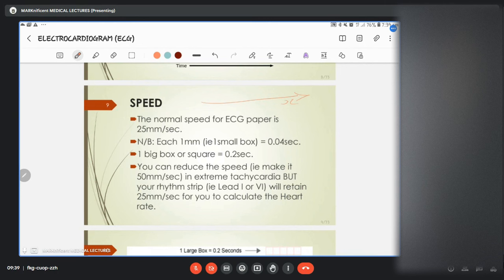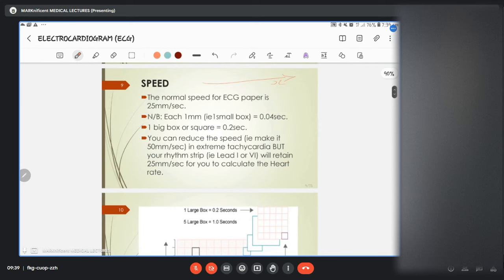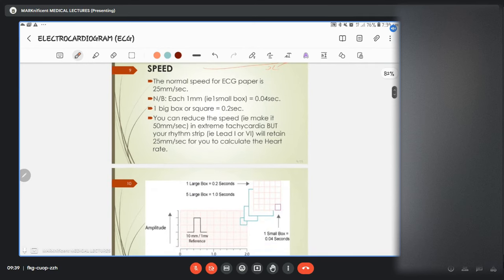So what this means is that on each small box, you have 0.5. No, sorry, on each small box, you have, okay, yes, you have 0.25, 0.04, sorry, I mean, here it is, 0.04 on each. When you multiply by 5, then you have about 0.2, yeah, about 0.2.